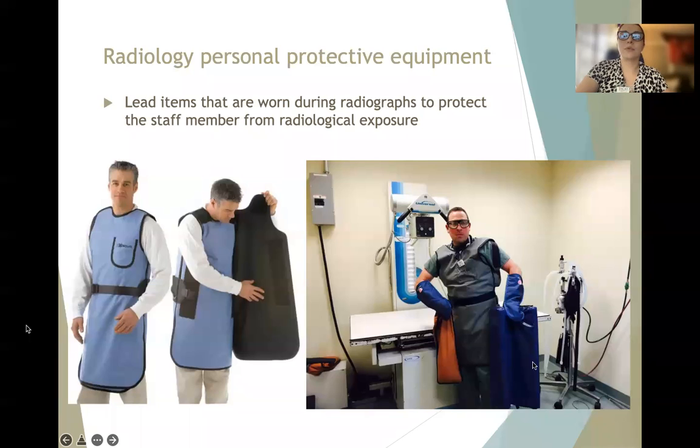the patient up against, or that V trough if you're doing that, patient being in the DV or the VD, which is that ventrodorsal recumbency. So on their back, and the beam is going to go through the ventral to the dorsal side. So using that trough can help make the patient a little bit more comfortable, and it won't impede those x-rays. Or we can use big sandbags to place next to them to keep them in position. As well, you're always going to have a minimum of 2 people taking x-rays.